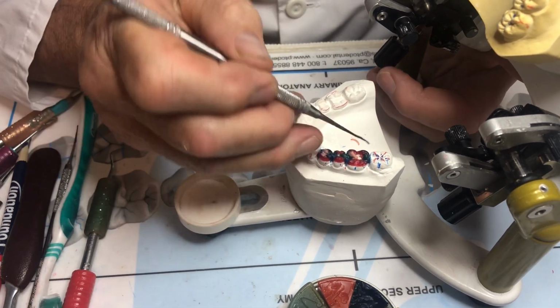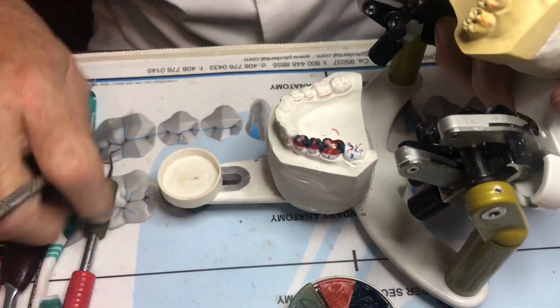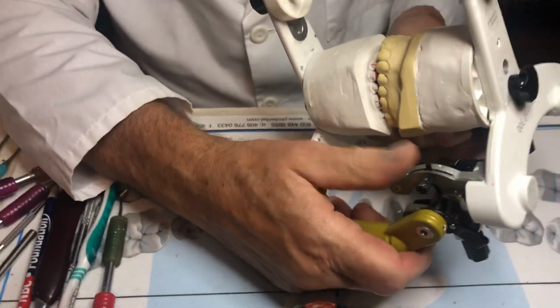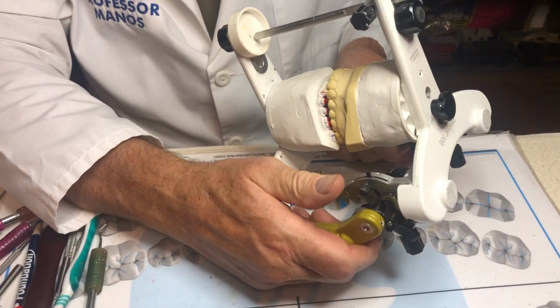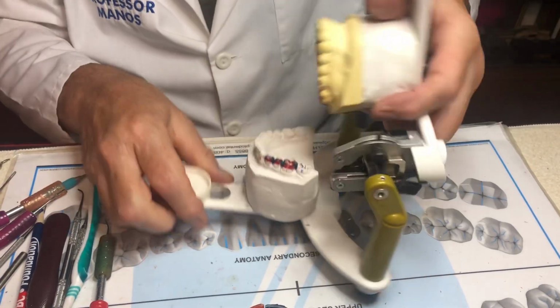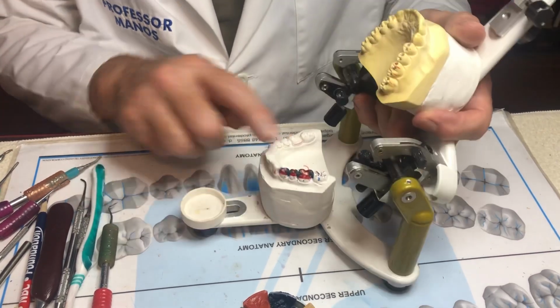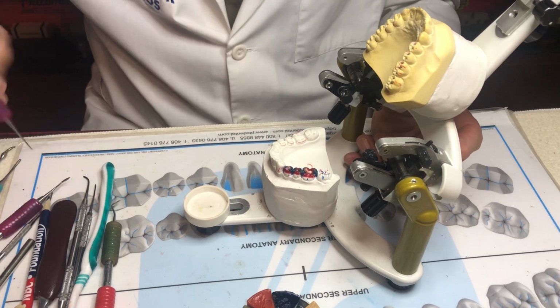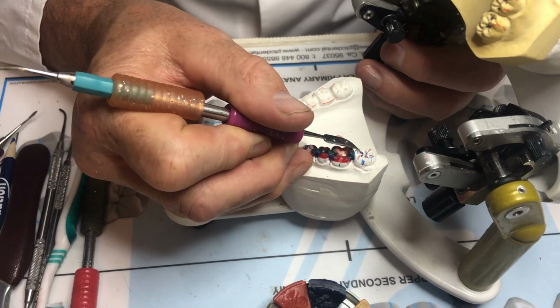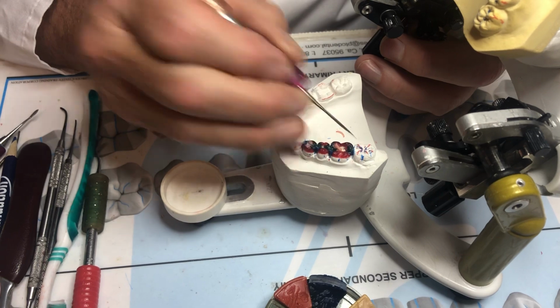Okay, so all I did, I waxed this one little cusp, close it down, touched in centric occlusion. Now move it working and balancing. Remember, put your thumbs on both sides. You can push with one thumb, push two thumbs, then both at the same time. I'm protruding, retracting, right and left, lateral movement. Look at it. I now have it, so now I've established the triangular ridge on the mesiolingual cusp. And if you notice, it curves, it goes into the center, the contact's down here.